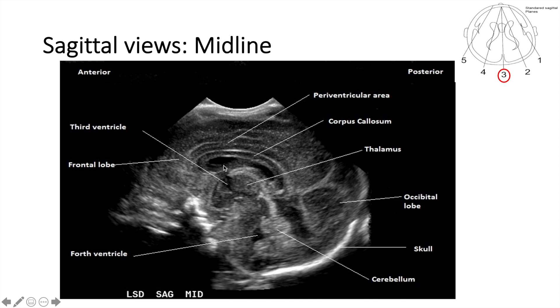This is the cavum septum pellucidum. You have the frontal lobe here, and this globe here is actually the thalamus. This is the occipital lobe, and the third ventricle is in the middle here. This is the cerebellum, and this is the fourth ventricle — you can see it here.